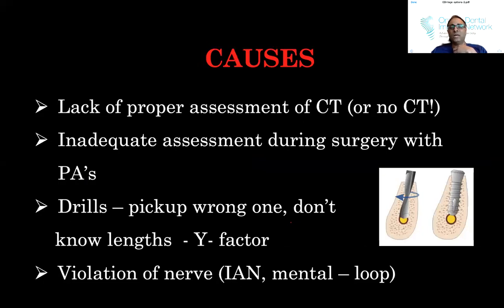But the causes are not assessing the CT, not assessing your surgery as you're going along with PAs and knowing where you're at, picking up the wrong drill. So your assistant puts it in the wrong spot and now you pick up a 13 when you should have picked up a 10.